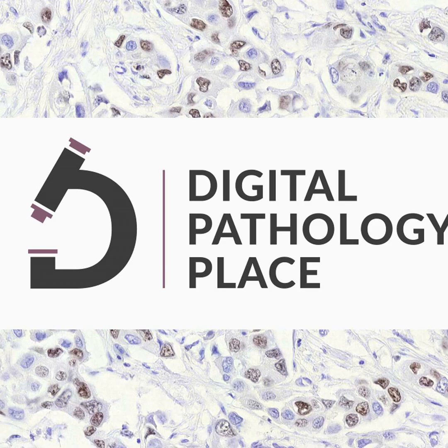We had the question of what implications it's going to have for the patient. So I'm just going to quickly tell you what this is about. It's glassless tissue imaging. Not everything is out yet because the exhibit hall is not ready yet. Anyway, long story short, glassless pathology: you image the tissue from the surface instead of making glass slides. Everybody comes here, pathologists, and they have their workflow in mind, and they look at it and I'm like, okay, where could it fit?